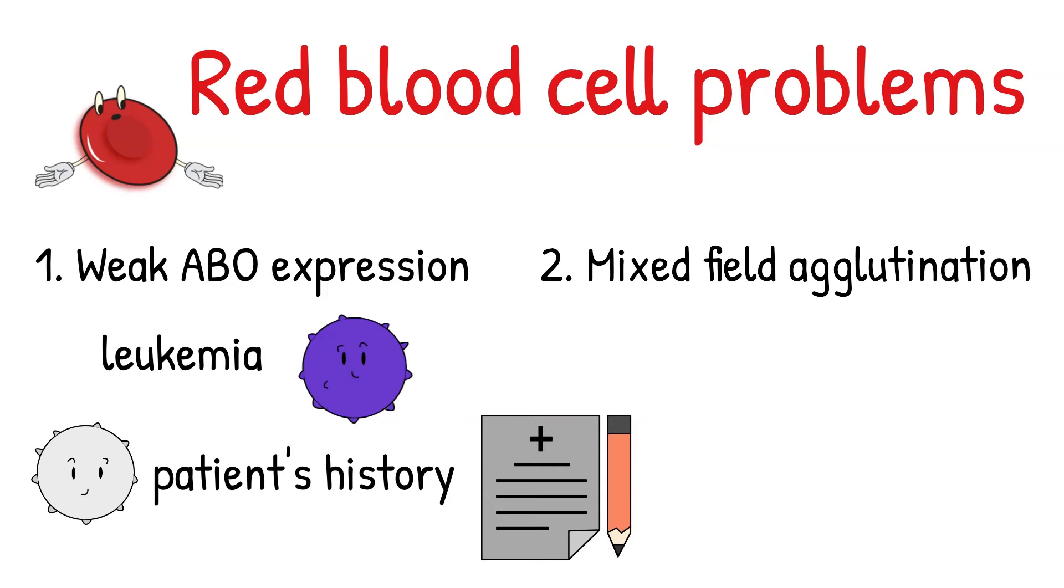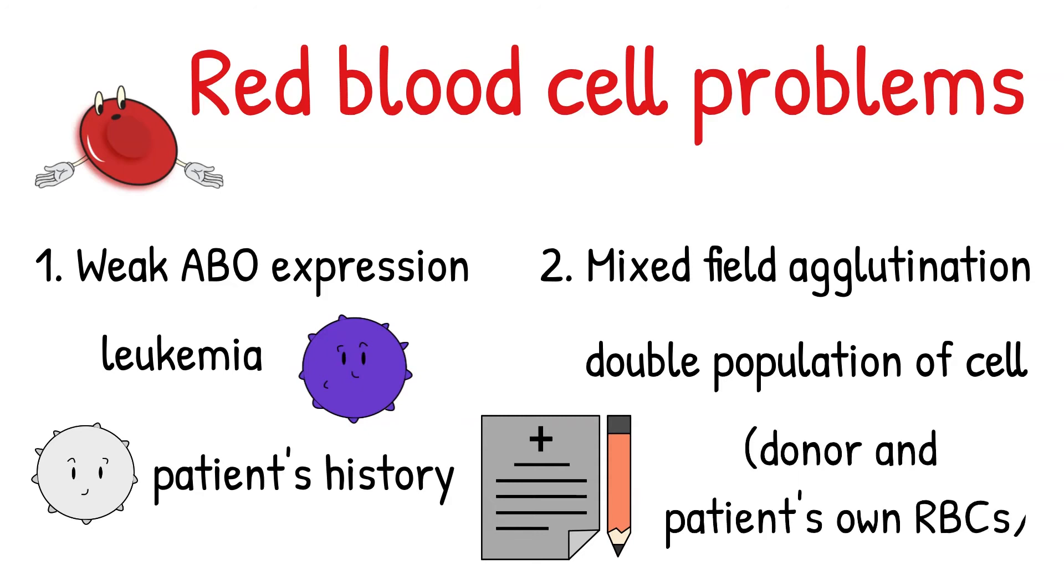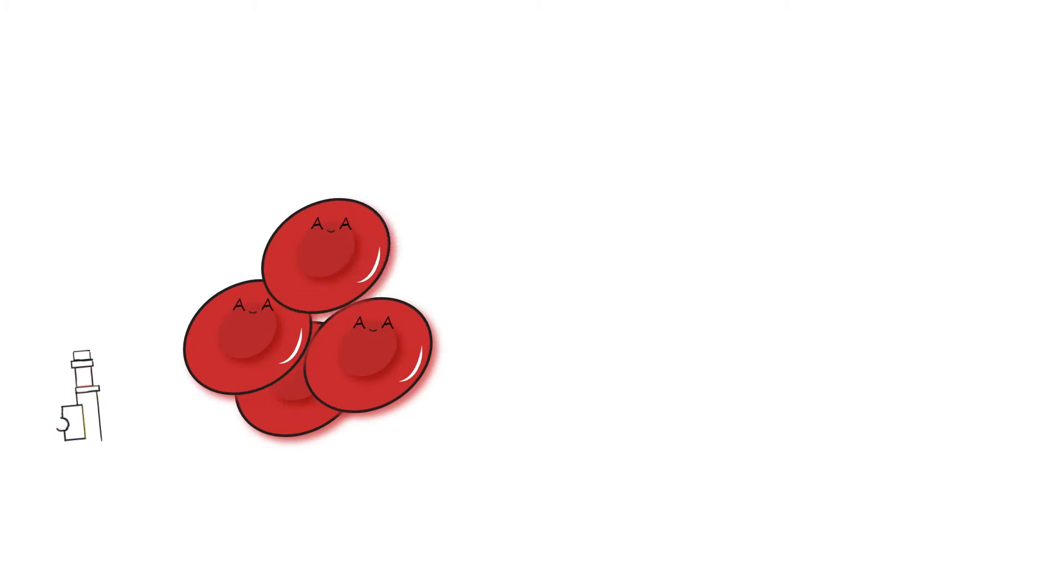Second, mixed field agglutinations. As the name suggests, there are the mixture of two population of cells. You see in patients who has been recently transfused. They are agglutinations and there are some free floating cells. This becomes more obvious when exam under microscope.